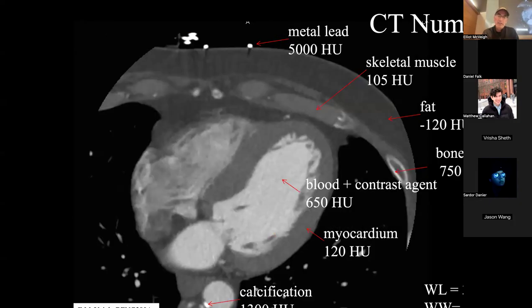Oh, the other interesting thing is this little piece of material there is a calcification. And usually when you have some kind of injury to vascular tissue, as it's repairing, it deposits something very similar to bone as it's scarring over and repairing.